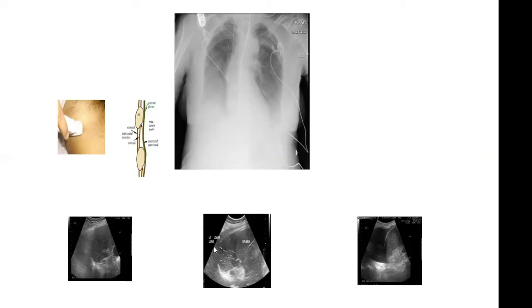The lung can become solid, which is in consolidation or pneumonia. This is on the left, and you have these branching structures, which are bright, which are the air bronchograms. Remember, we're just looking at the same pathology and anatomy on a different platform. Or there can be no image whatsoever because it's got pleural fluid on the hemidiaphragm and there's through transmission of sound waves. So ultrasound can be very helpful where clinical examination is either difficult, i.e. in supine patients, or just can be difficult because of interpretation.